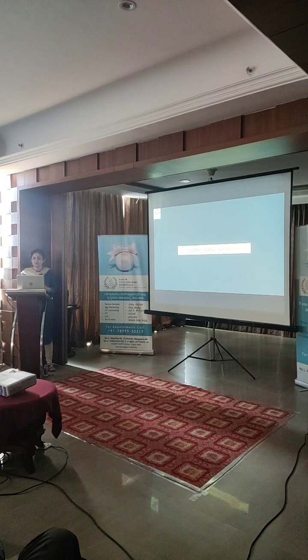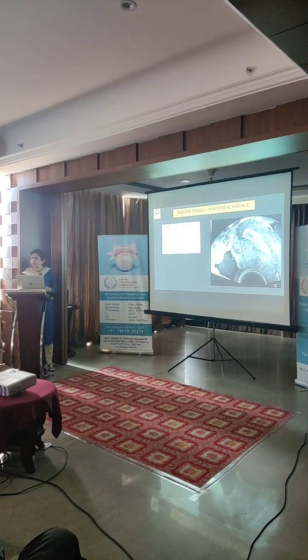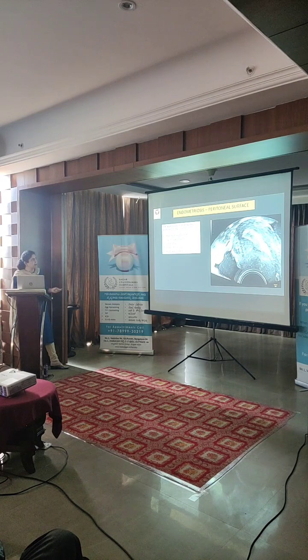Then we moved to superficial endometriosis. For a long time, we thought that it is impossible to pick it up, but of late there have been a lot of articles showing that if you observe carefully the peritoneal surface of these pelvic structures, particularly with fluid in the pouch of Douglas, you may pick up hyperechoic projections, hypoechoic areas, small cystic areas. I didn't have time to put all the videos: flimsy adhesions, peritoneal pockets, etc.